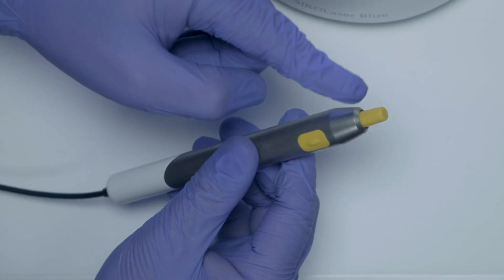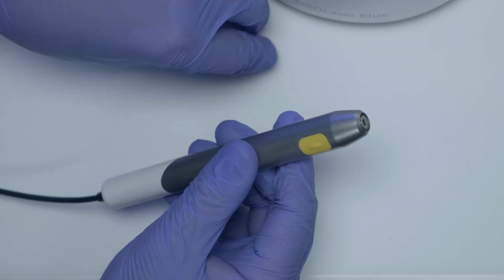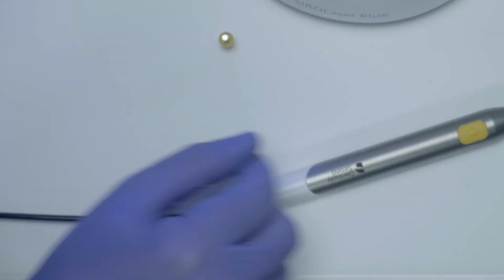From time to time, it may be required to clean the handpiece optics. Remove the protective cap from the connection socket at the handpiece and make sure that the device is switched off.